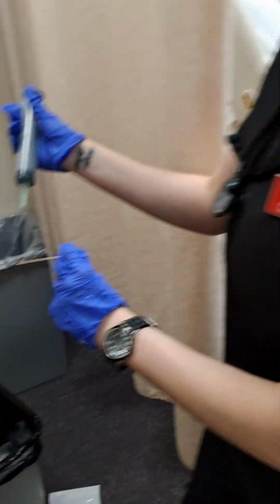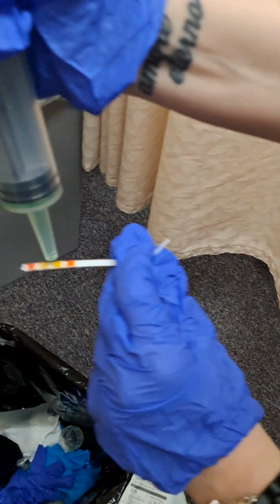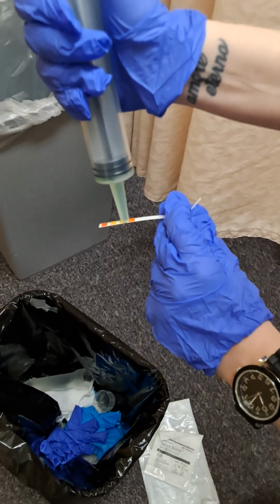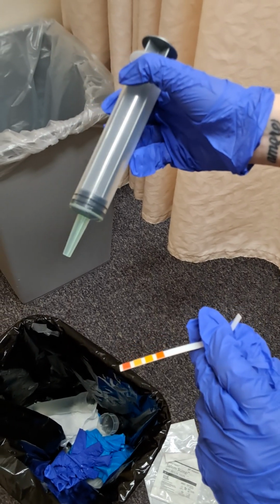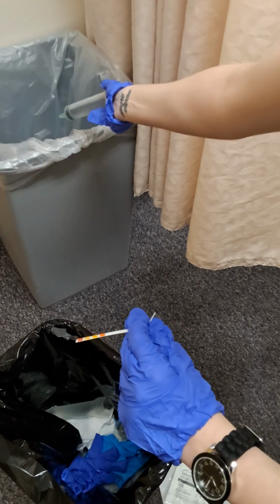So it's over the trash can. I'm still in the patient's room. Okay, now this will go to a biohazard bag since it has the GI contents in it. This is the biohazard right here.